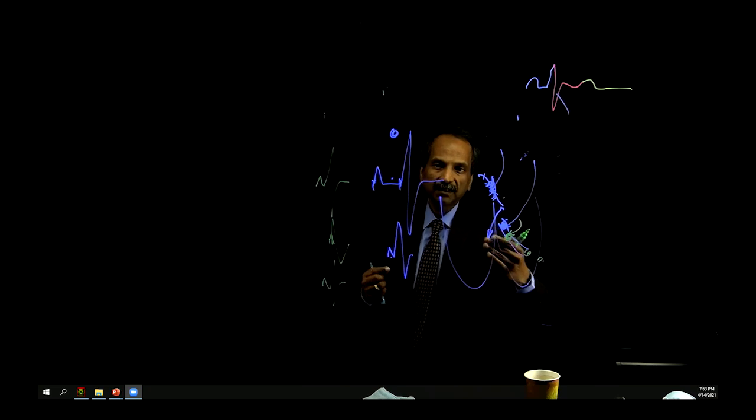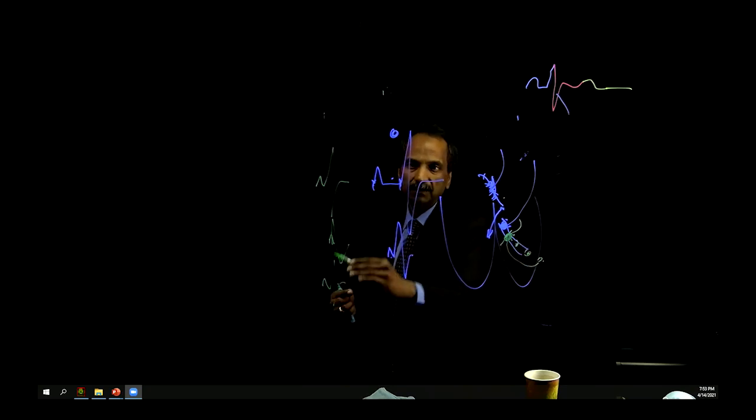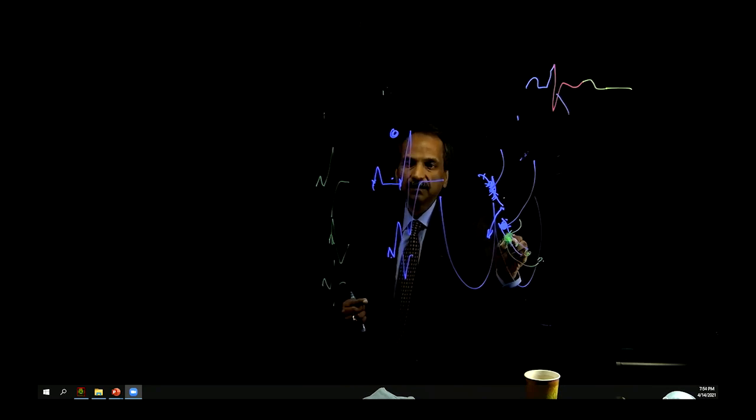So you'll have to understand the axis of the conduction system and find the highest possible site where you get the match, because anything lower than that will still match the signal. So the highest site that gives you that, you're probably at or very close to the focus.